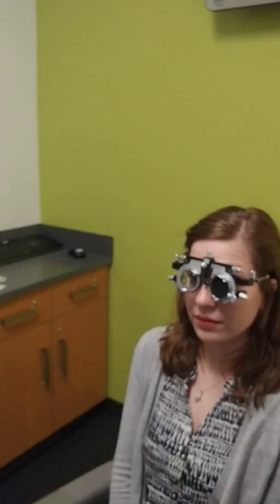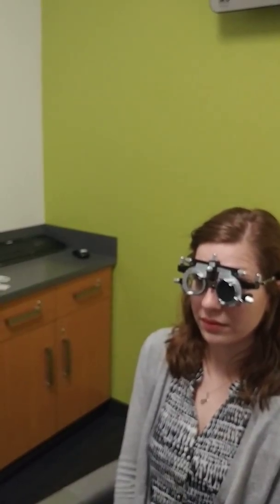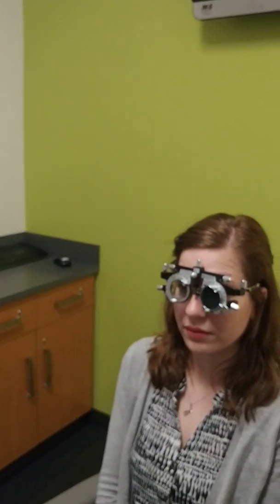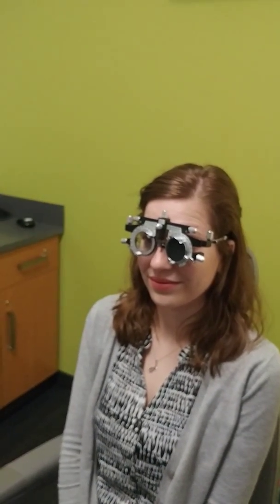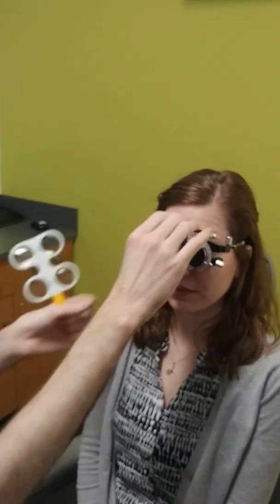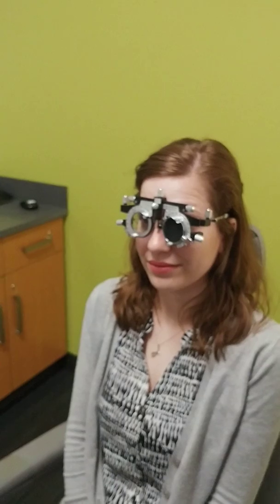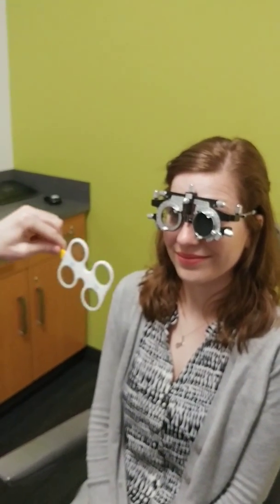It's pretty simple to slip the lens into the back well. The main key when inserting a lens while the patient is looking at something: have the patient close their eyes if you're not used to it, angle the lens away from their eyes so you don't poke them, apply some counter pressure, and every time you put a lens in, lift the trial frame slightly so you're not pushing it into their face.